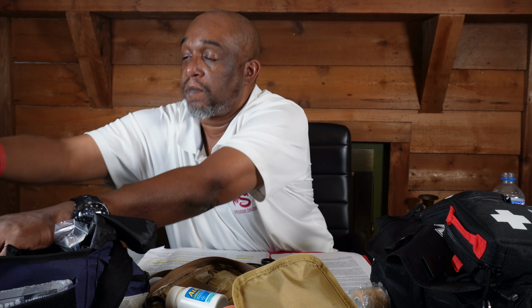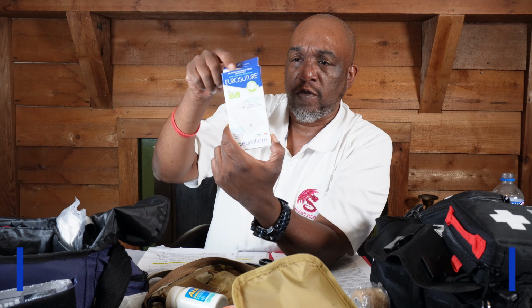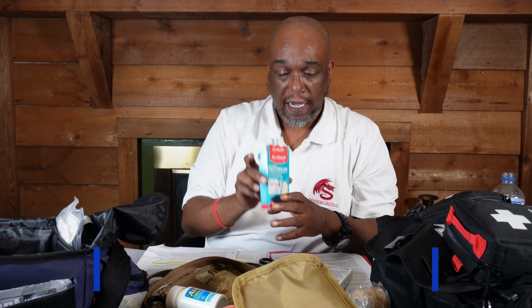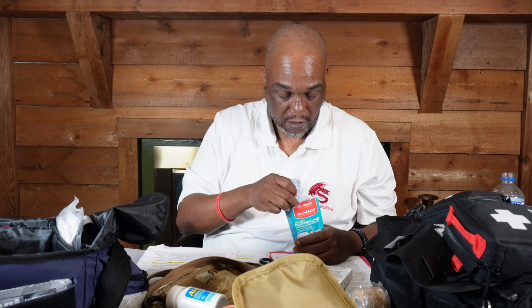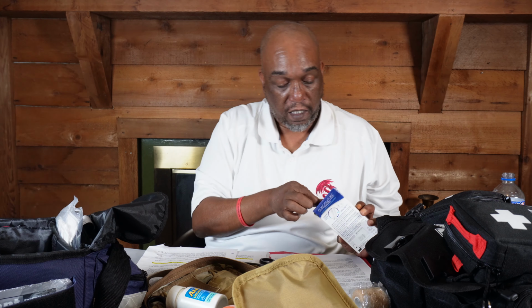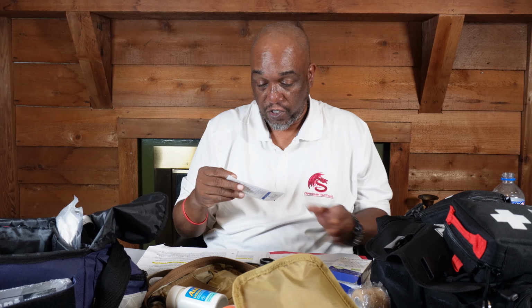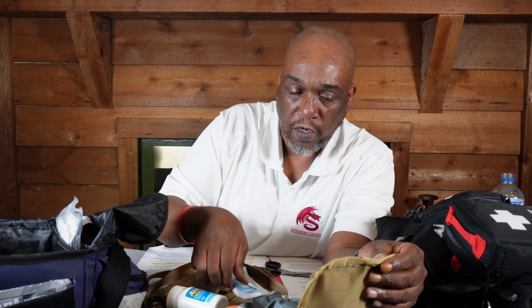I also have, I'm gonna add, let's see what I got here. And these are the little strips you kind of put over cuts to help close them up. And then I got a couple other kinds of bandages, fast healing. So I'm gonna grab a couple of those. Yeah, and these are just gel bandages. So I'm gonna add a couple of gel bandages and maybe just 1, 2 bags of strips. So I'm gonna just add that to my kit. Like I said, I got the main things I want in there, just other this stuff.